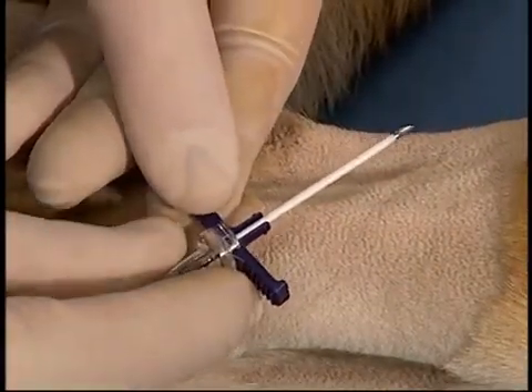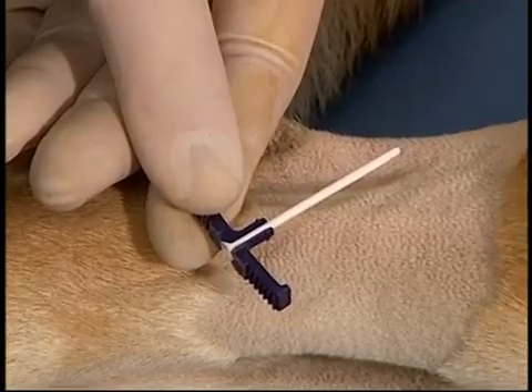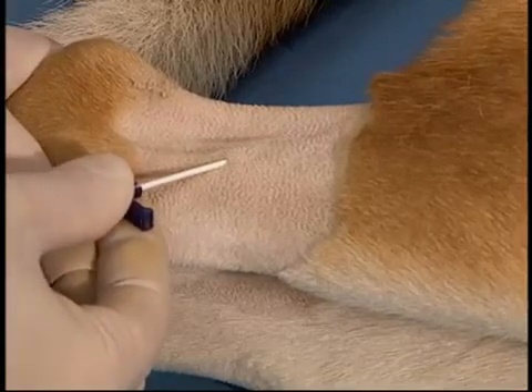The patient should be clipped, surgically prepped, and draped. The drape has been left off for visualization purposes. The sheath with its inner stylet should be inserted through the skin and into the vessel.